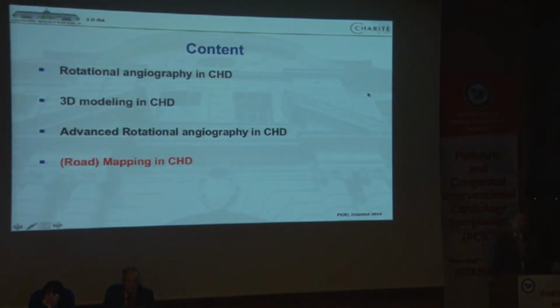But the future is not really focused on the advanced rotational angiography, because this enlarges and prolongs the acquisition time to roughly 5 seconds, and means that you have to plan your dye injection for another half a second or 1 second, which means 7 seconds of diluted dye injection, and that gives you an amount of contrast medium load which is probably significant for the patient.